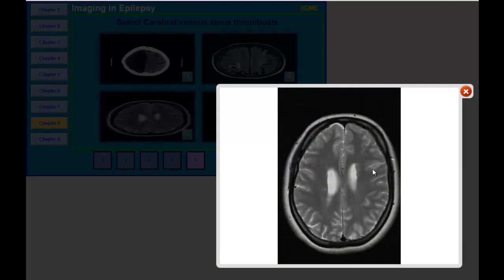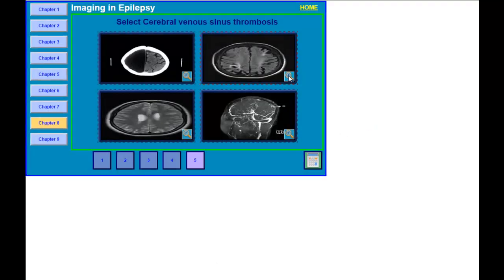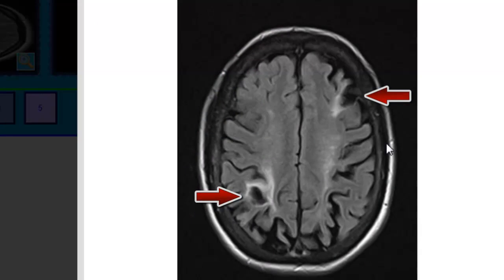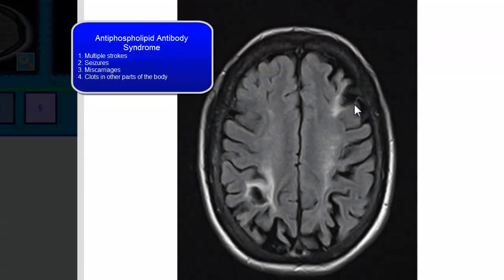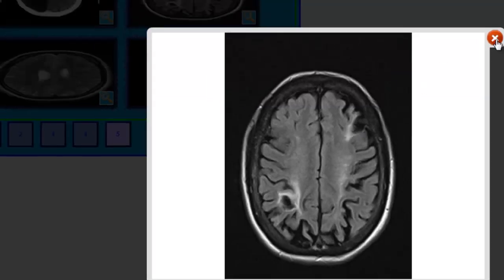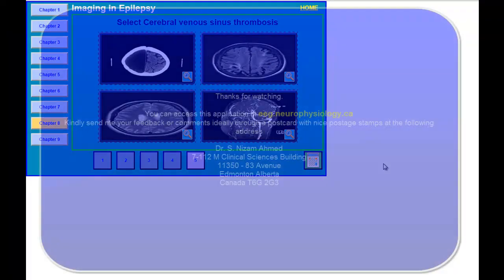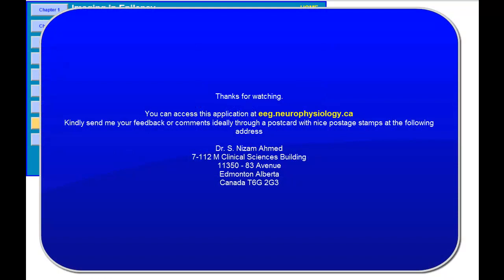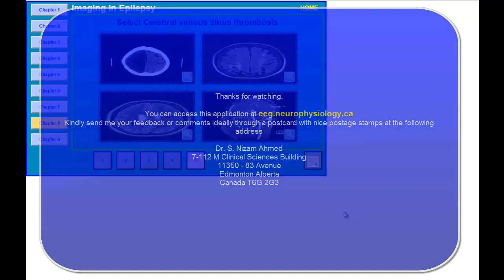This is another example of periventricular nodular heterotopia. And this is a patient with multiple strokes — a stroke on the right hemisphere and a stroke on the left hemisphere. Patients presenting with multiple strokes and frequent miscarriages should be investigated for antiphospholipid antibody syndrome. That's pretty much it for the tutorial today. I hope you learned something from it and I will see you at the next tutorial. Thank you very much.